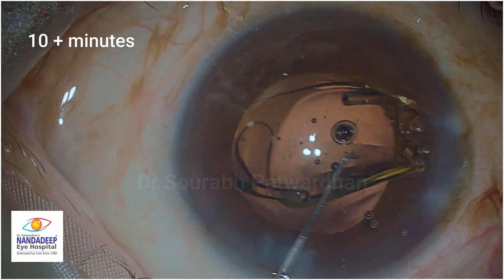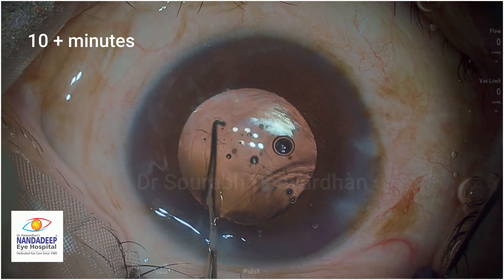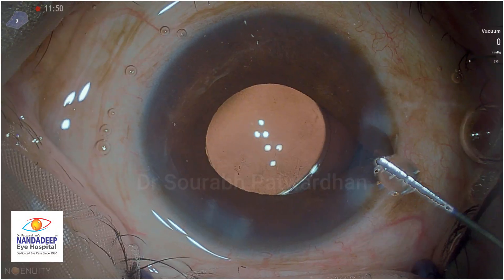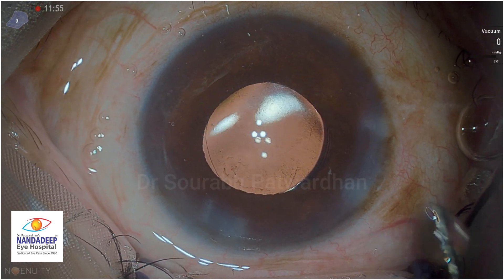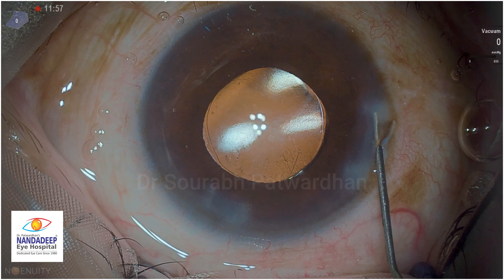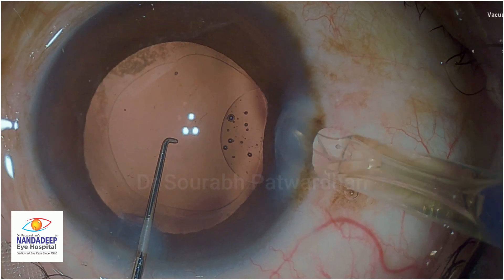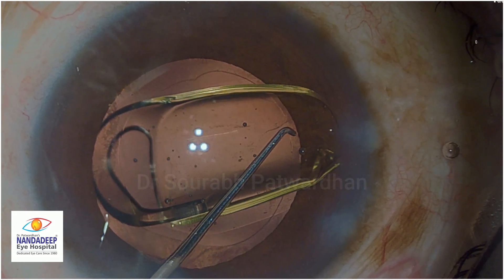Can you guess why I was waiting that long? Probably I waited for something. You could see that I finished my case by the 12th minute. Let's go back and start from where we left at the end of 5 minutes. I am injecting the IOL here - and there it goes. That's what happened.